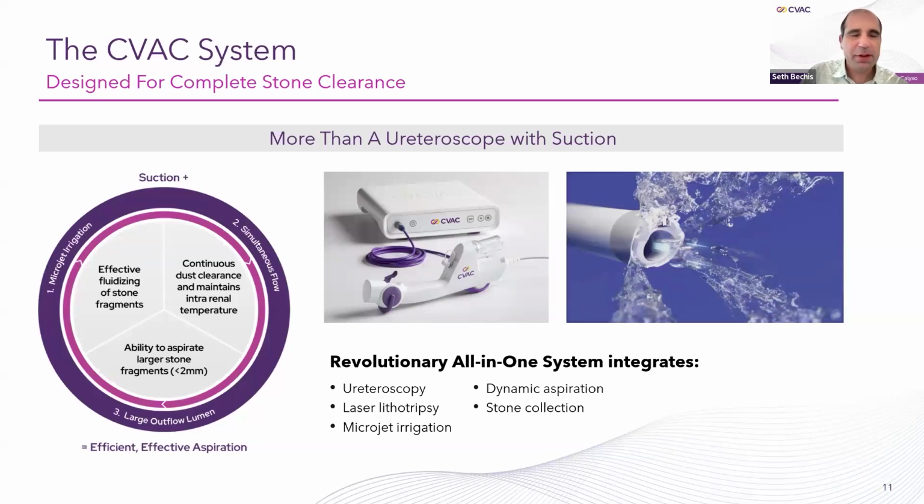So then there's the evolution of the device. Now there's the contemporary CVAC 2.0, as we call it, which married a ureteroscope to this device. So not only do you have the aspiration and the irrigation, but you have direct visualization. And I would say, compared to other suction devices that are currently on the market, this device has a unique design because it has three things.